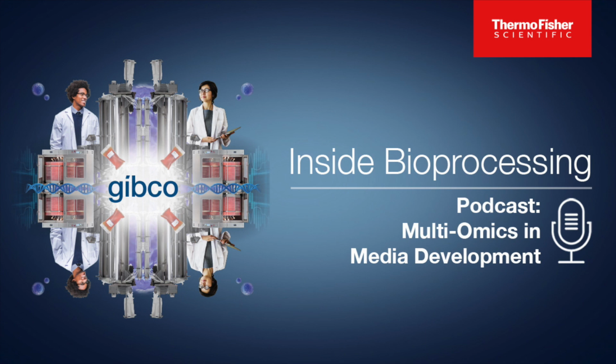To give a sense, a spent media approach data set will probably give you maybe 100 to 200 megabytes of data. Relatively easy data to utilize, with simple programs to be able to analyze and determine what your next step should be. A multi-omics data set can be upwards of 500 gigabytes in size. It's looking at 7,000 proteins, 1,000 metabolites, and it's looking at it across a time course and also in the context of the cells, where those proteins actually exist in terms of the organelles or the structure in which they are related to each other.